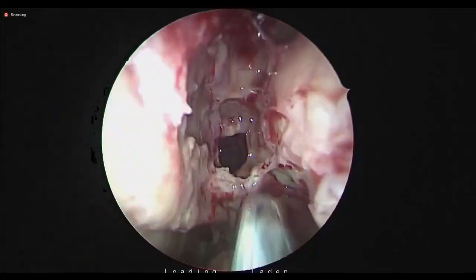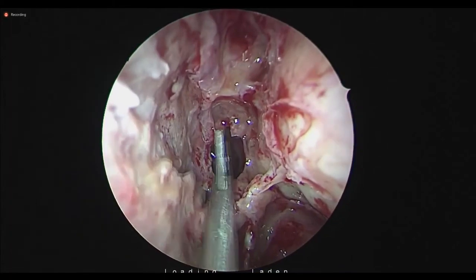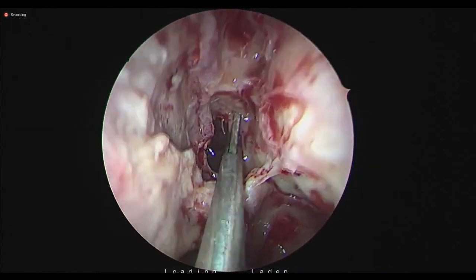Not a branded one. This is 1 HP. Okay, it's normal regular suction only. Not a regular one.